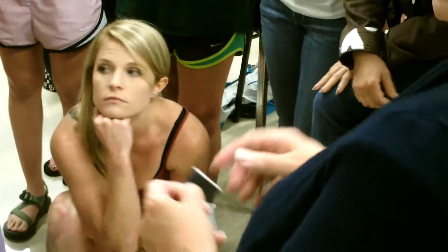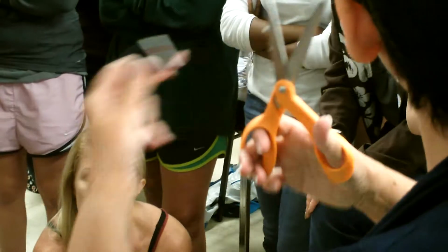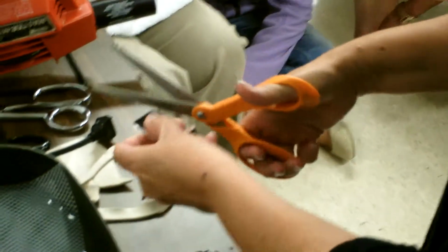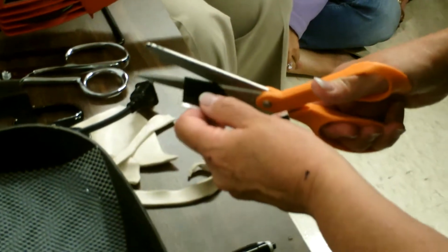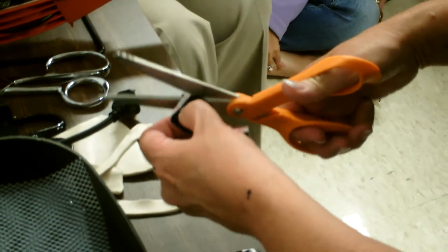Now you tell me about your quirks. Miss Irma, who is on faculty here, hates just squares. I make them round. So Miss Irma, remember I said don't use those kind of scissors. And these scissors, occasionally we got to get Goo Gone and get all the gunk off these. But Miss Rita will round these. The reason they round the ends is because then it won't peel up.